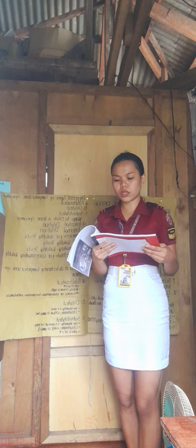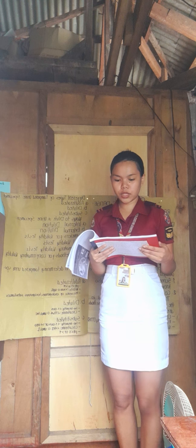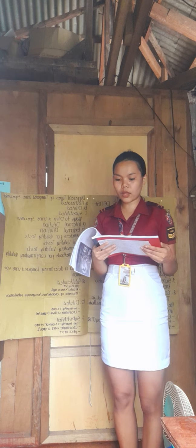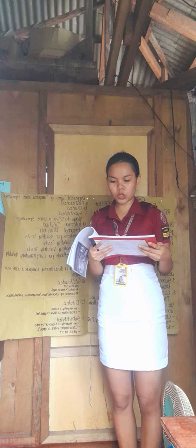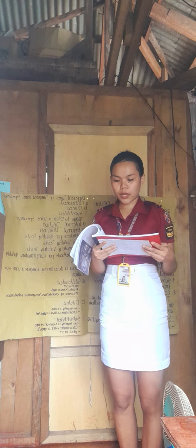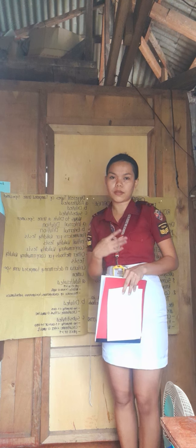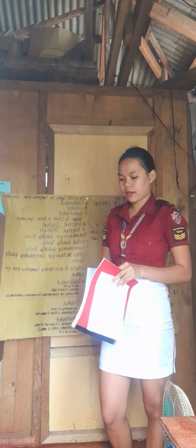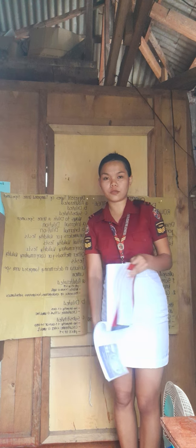So when do we consider a urine specimen as invalid? So a urine specimen is considered invalid under the following circumstances: adulterated, substituted, or diluted, improperly collected, handled, and stored, improperly documented. So that was all about chapter 7, the examination of dangerous drugs.